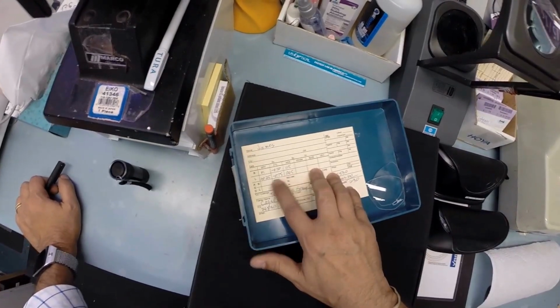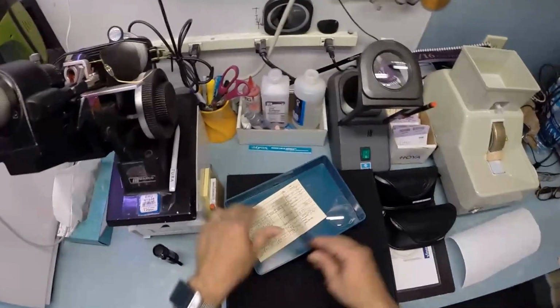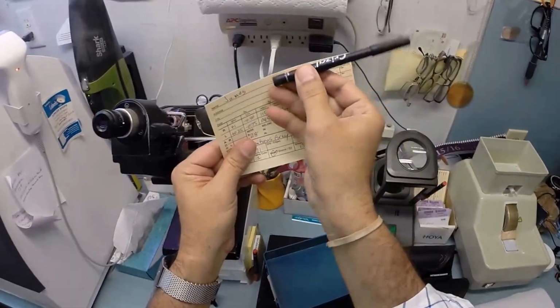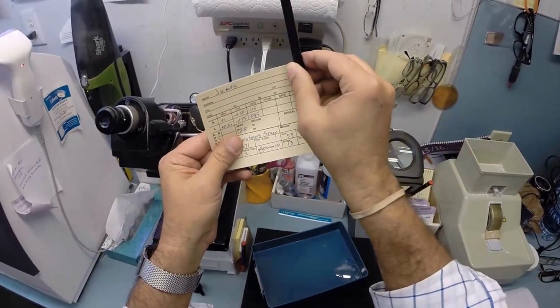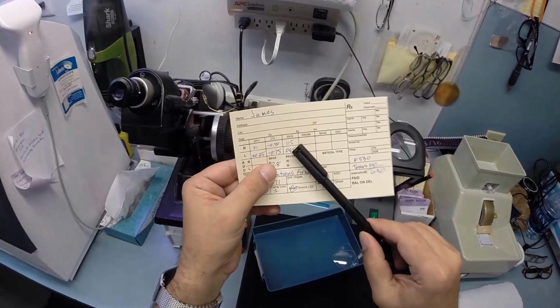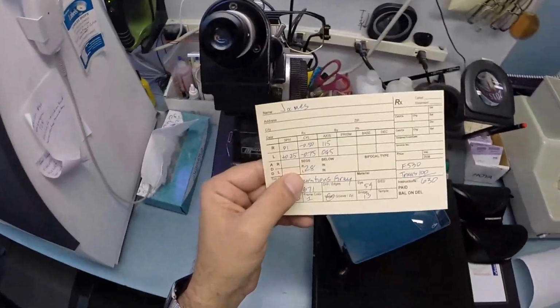Now, the first 2 numbers are real values to be concerned with. This last number could be anywhere from 0 to 180. A straight line is the cap over here, 0, 90, 180. For your right eye, we're going to turn that knob just past 90 to 115. For your left eye, we're going to turn it to just past 90 to 95. Now you're actually within 10 degrees of each other, excuse me, 20 degrees. You're at 95 to 115, so I find that curious, no one else will.